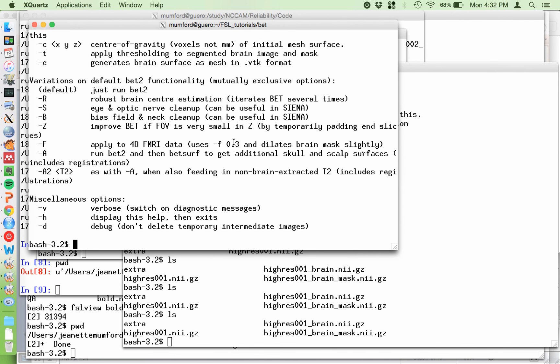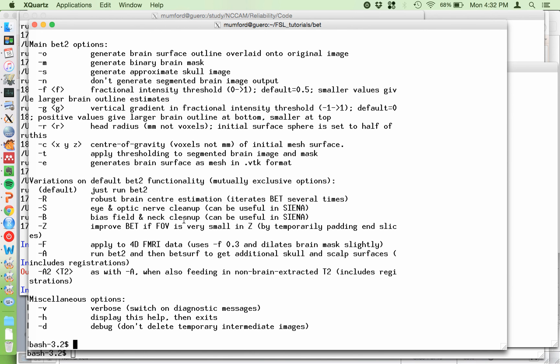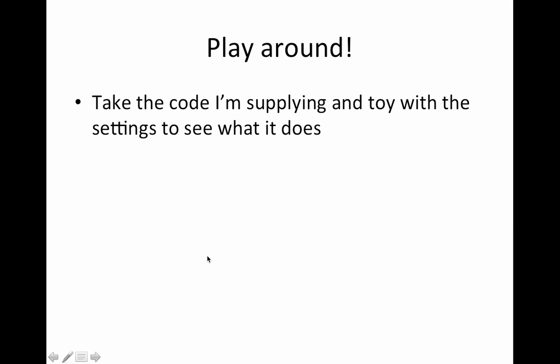If you just type BET, you can see there are quite a few options. Some are used for SIENA. Sometimes minus B one helps a little bit. If you're doing 4D data you'll have to use the minus F option, but we're not doing that — we'll handle that in the level one analysis. Don't just use the code I put in the script and assume it's going to work for your data. Start with one or two subjects' structurals, toy around with BET, see what works best. Just take a little time to play.